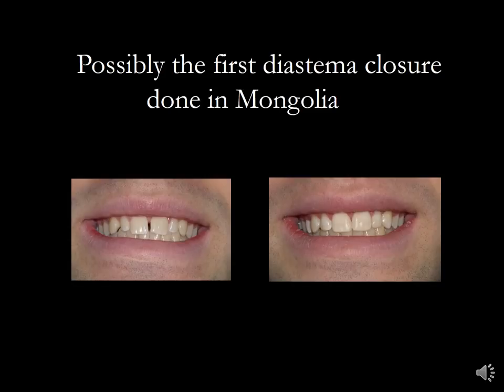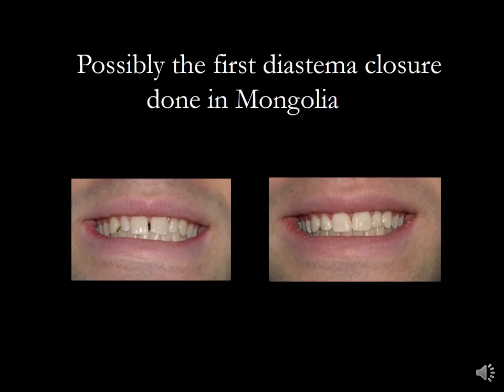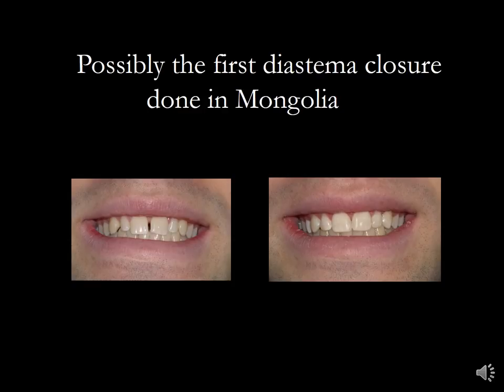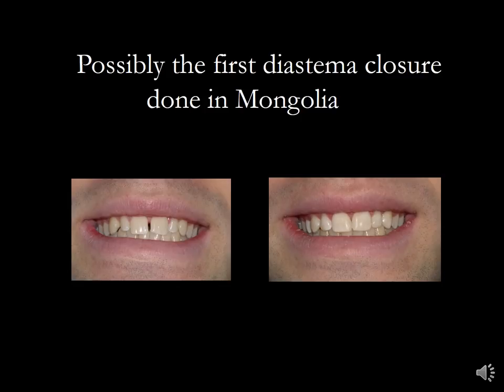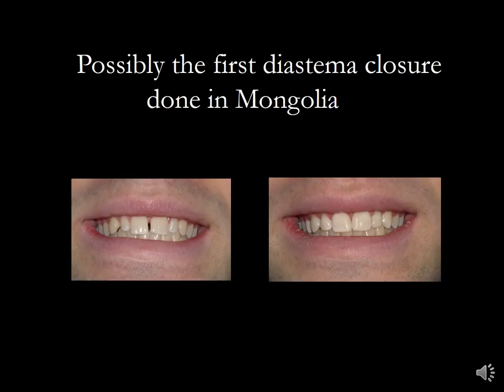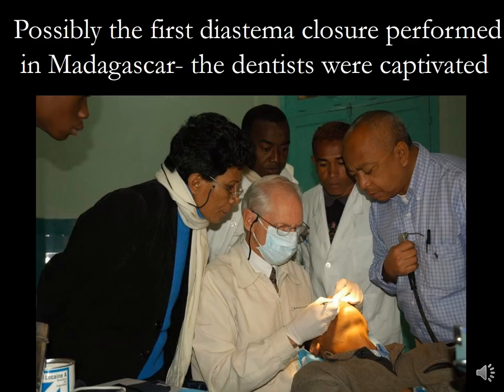When I was in Mongolia training dentists, they had not seen this type of procedure done before — so this possibly is the first diastema closure done in Mongolia. You can see that these teeth are fairly wide to begin with, so we would want to curve the contact back in lingually. Also, the lateral incisor was lengthened slightly, and the incisal edge on tooth number nine was brought down to even things out.